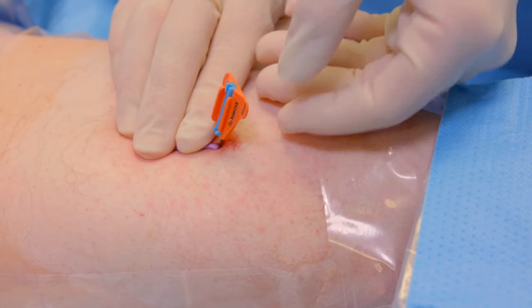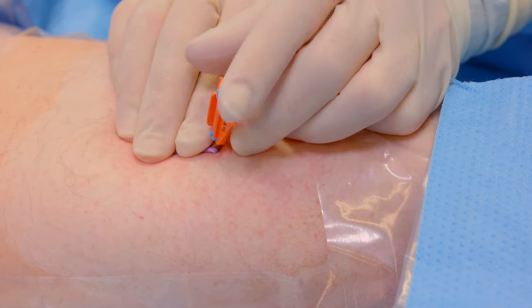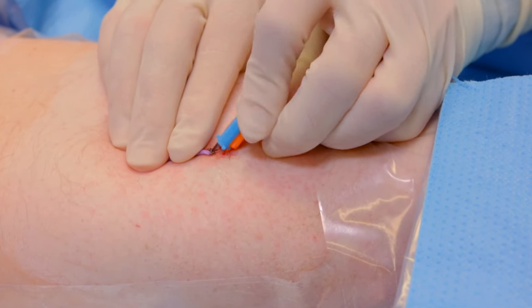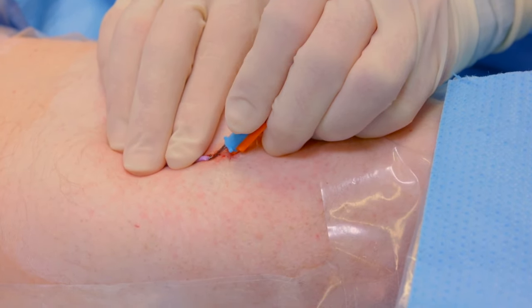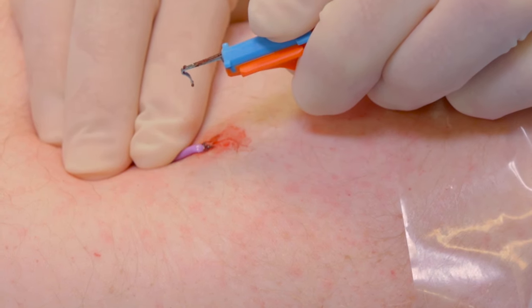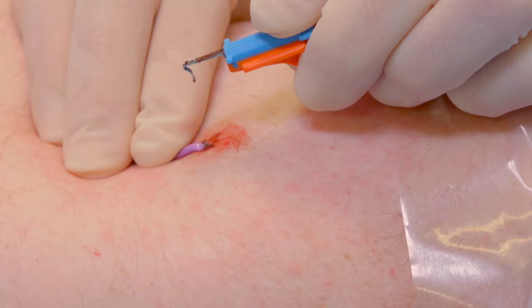Apply firm pressure at the insertion site. Fold the wings of the base downward to bring the feet together beneath the skin. Place your index finger on the top ridge of the folded base. Hold the folded base horizontal to the skin surface. Use a swift, deliberate upward motion to remove following the shape of the feet.